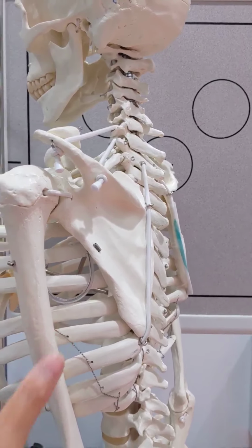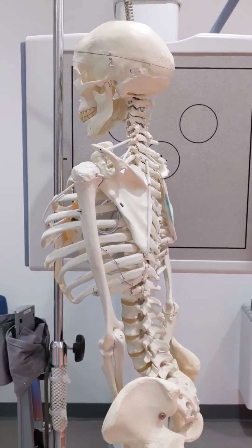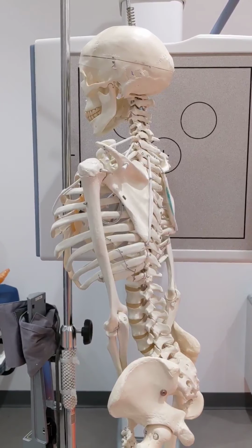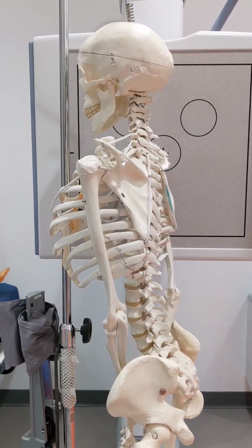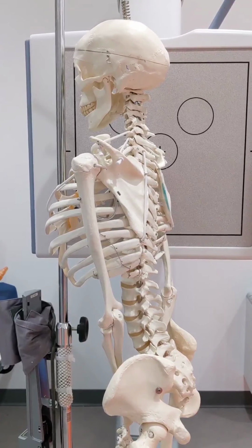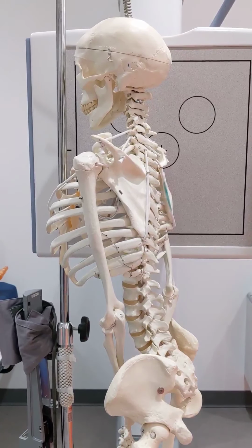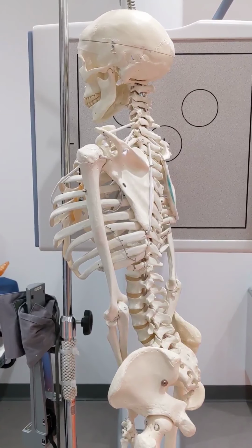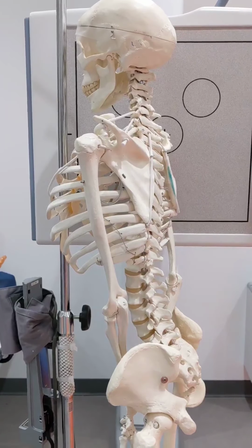So I'm just going to let go of the skeleton and take a step back. And what you'll see is that the skeleton is actually in an RAO position. So his right anterior oblique aspect is the closest to the IR. So for a Y view of the right shoulder, what we need is an RAO position.